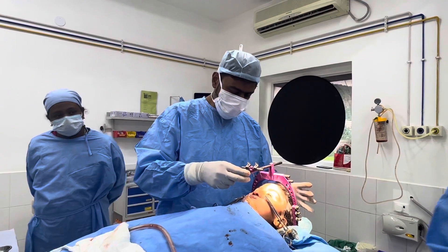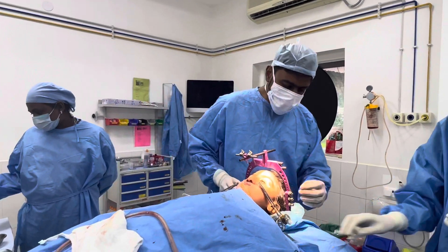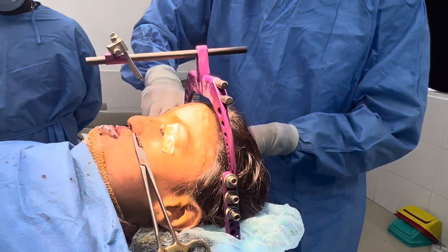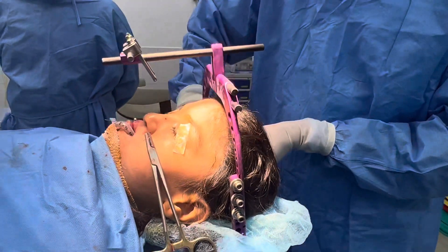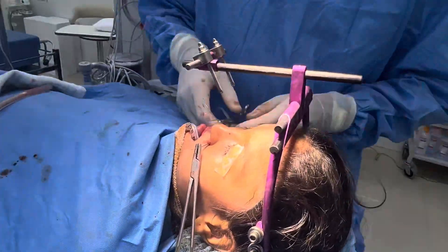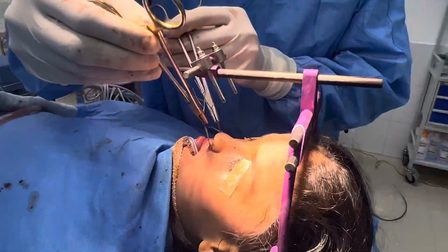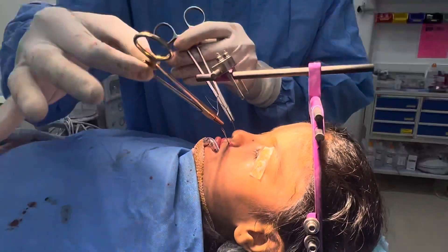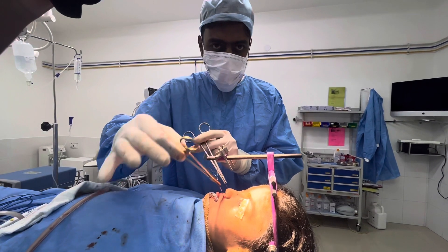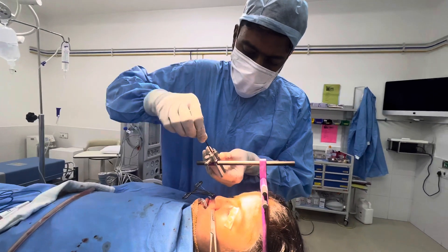We've just fixed a rigid LeFort I halo device for this patient. We've used three screws here on this tab — this is called the halo frame — and three on this side. It looks quite a contraption, and this is adjustable. These are the wires coming out by the side of the nose, but the entire upper jaw is on these two wires. These wires are in turn attached to plates and screws which are on the upper jaw to distract or retract the entire upper jaw.